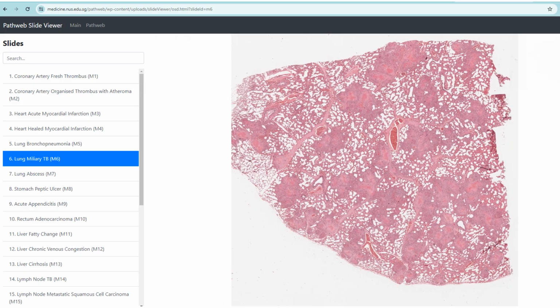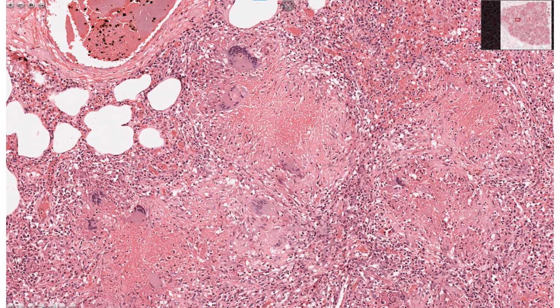The next one is pulmonary tuberculosis. You can look into the tissue in the virtual microscopy slide there and focus on any point, and you can see all the four main features of tuberculosis as you have learned in your basic pathology. The central part is what we call caseating necrosis. Surrounding it are chronic inflammatory cells, the small-nuclei cells, right?